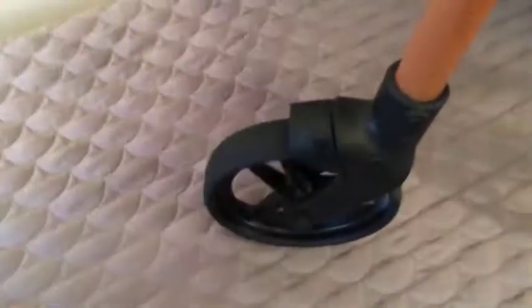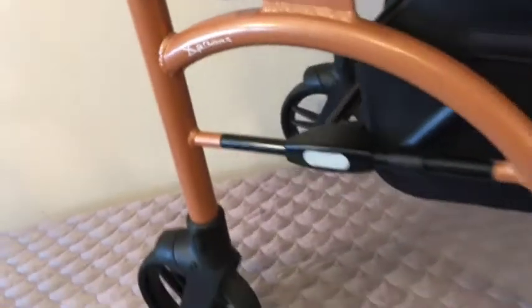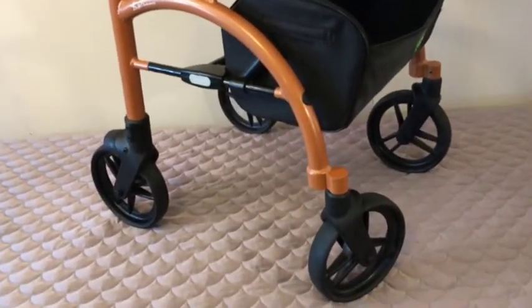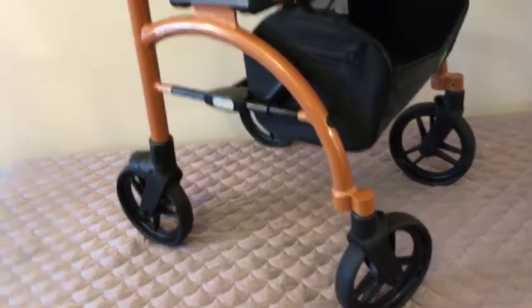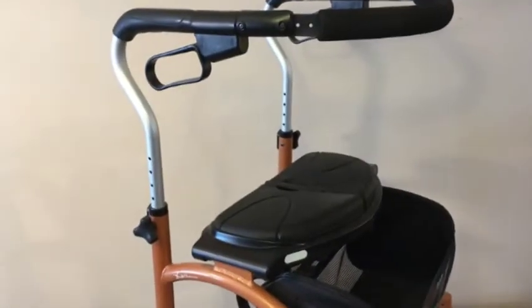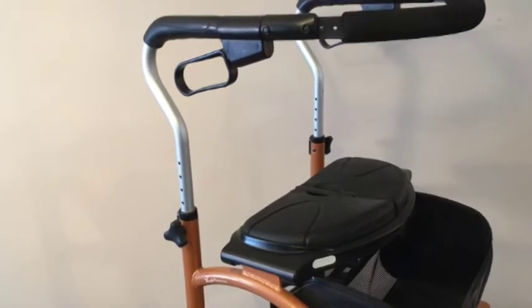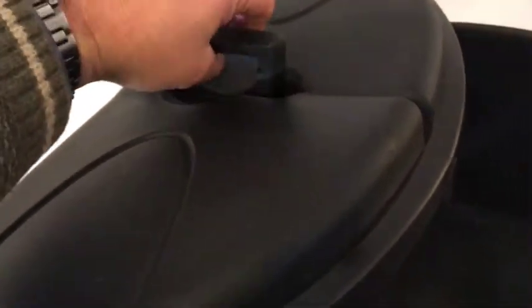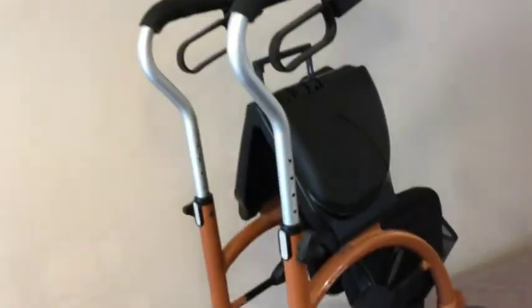It's a great unit. Rollators aren't getting any cheaper. If you've got an allotment from the government to get personal aid, that's great, but a lot of folks don't — or maybe you've used up your allotment and want an extra unit for traveling. This one travels real nice; all you simply have to do is give a lift and instantly your unit is ready to stow in the trunk or in the back seat.